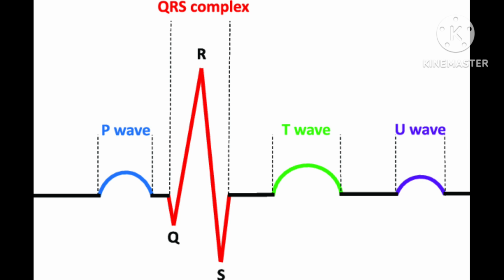The second important thing: the electrical activities of the heart are measured, interpreted and printed out. And here again, an important point: no electricity is sent into the body. This is very important. One should not think that current is passed. No electricity is sent into the body.